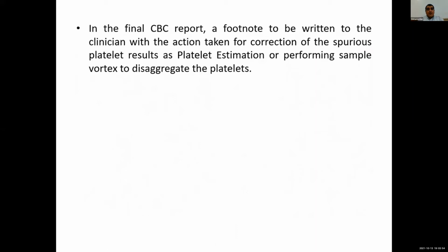And also here, as we mentioned before, it is very crucial and important to write a footnote to the treating clinician with the action taken for the correction of the spurious platelet results, such as platelet estimation or performing sample vortex to disaggregate the platelets.